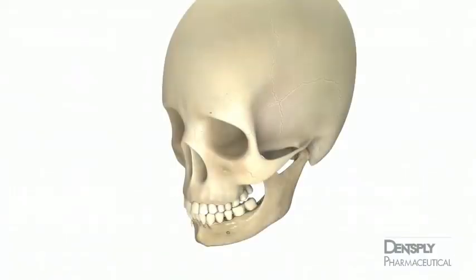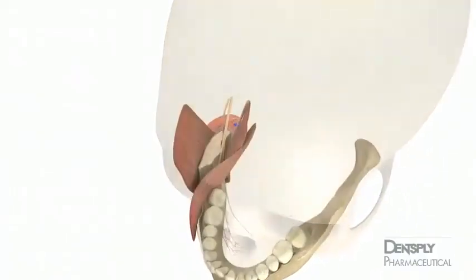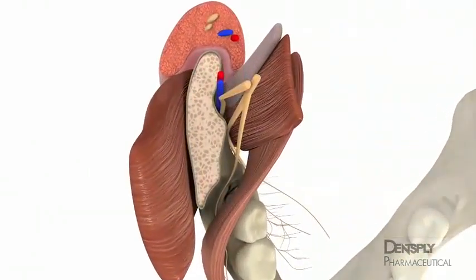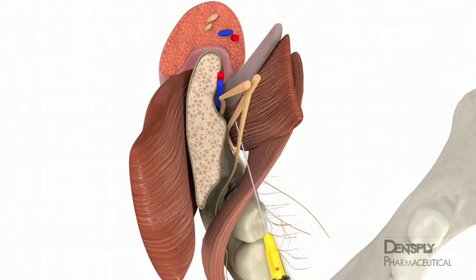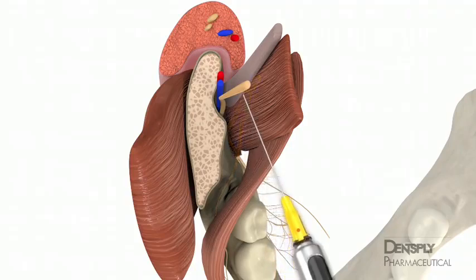In the patient where no bone is originally contacted after an insertion of 2.5 centimeters, there is the possibility that the needle tip is medial to the mandibular sulcus. Deeper insertion is not advised because of the potential for penetrating the parotid capsule and anesthetizing the facial nerve. Depositing the anesthetic at this point will still usually produce mandibular anesthesia. In the few instances when anesthesia is not obtained, perhaps because the sphenomandibular ligament and attendant fascia prevent lateral spread of the local anesthetic, re-injection will be necessary.